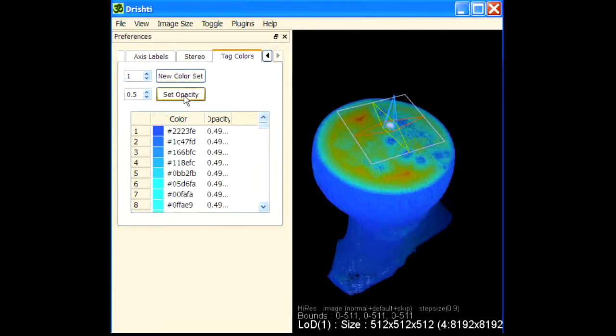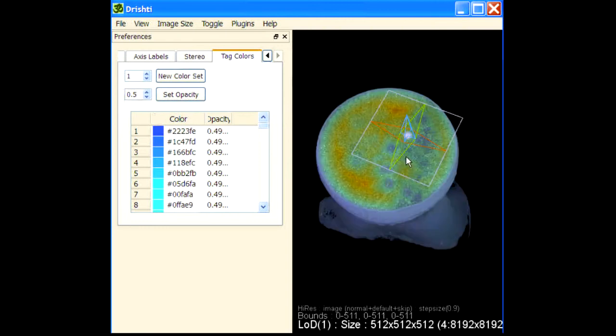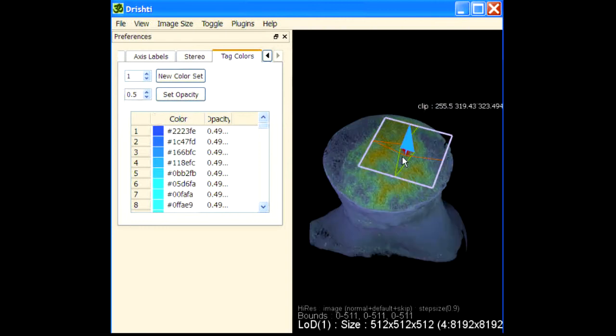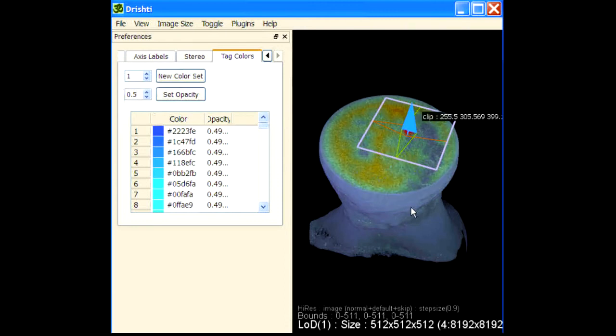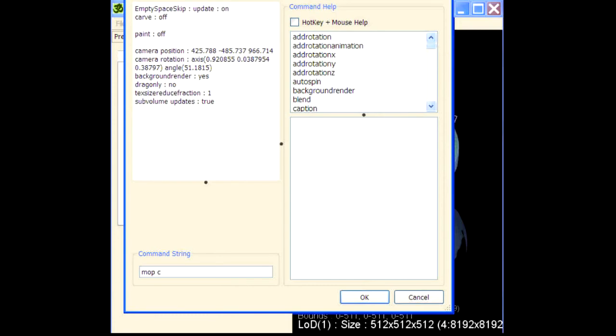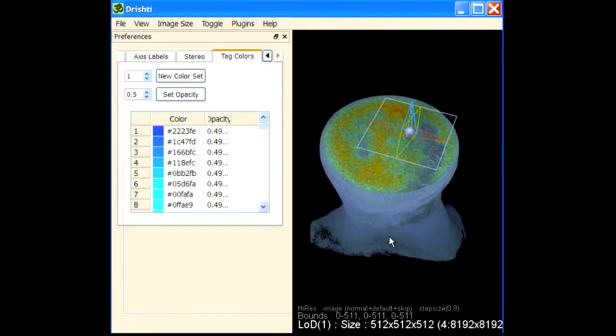Set opacity to 0.5 and this is the result. You can also apply city block transform and see what is in the top layer. Remove first couple of layers here.